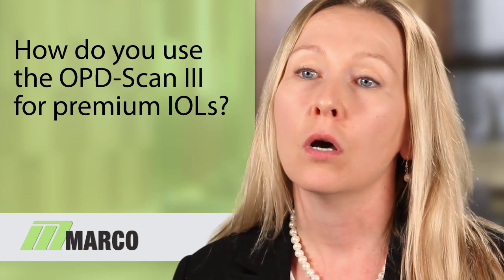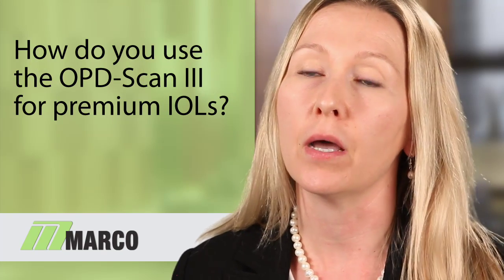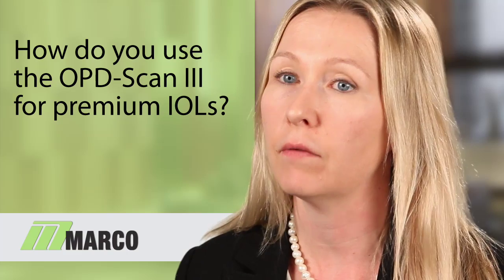A lot of people forget to look at the pupil size, and that is an important factor when it comes to premium IOL implantation. So that picture of a pupil with angle kappa included really reminds you of the patient's size of the pupil. And so you've got two pieces of information which are very important looking at this patient and whether they're a candidate. You look at pupil size and you look at the angle kappa, and you can determine if a patient would be a good candidate for premium IOL implantation.